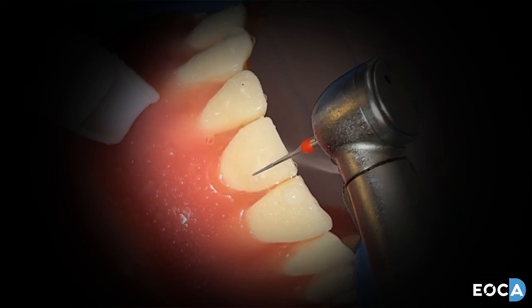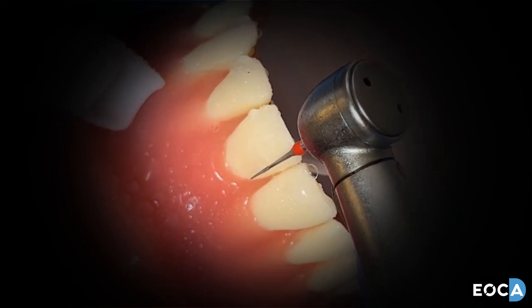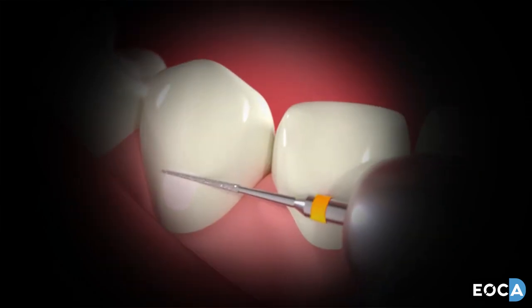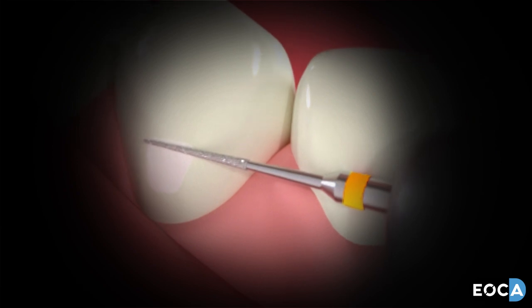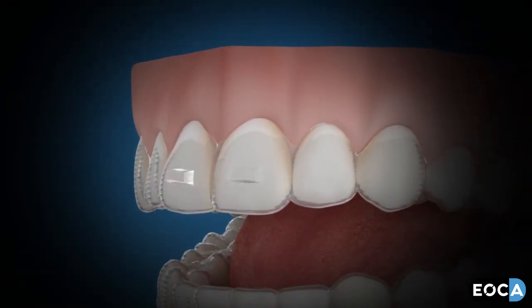Once the body of the attachment has been removed, change to the red burr and polish the attachment completely away back to the enamel surface. Then swap to the superfine yellow band burr and polish the enamel to a high luster. Application of topical fluoride is highly recommended.